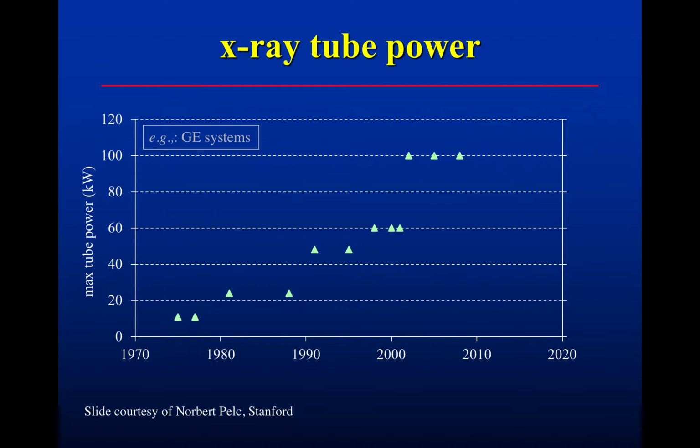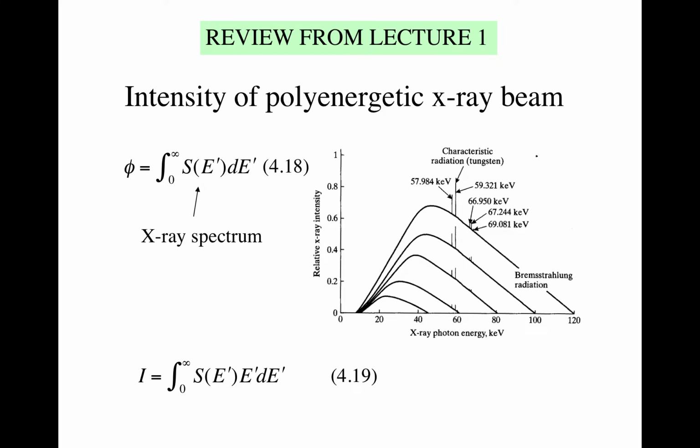So, take 100, you know how hot a 100-watt bulb is, right? Everybody, I guess you do, yeah. So you're going to take a 100-watt bulb, now take 1,000 of them, right? And then put a big lens over top of you and turn them on. That's the kind of energy that's coming down here, right? And it's all done in a very short period of time. So it's a lot of power. And they're becoming more powerful because we want to image in shorter and shorter amounts of time.